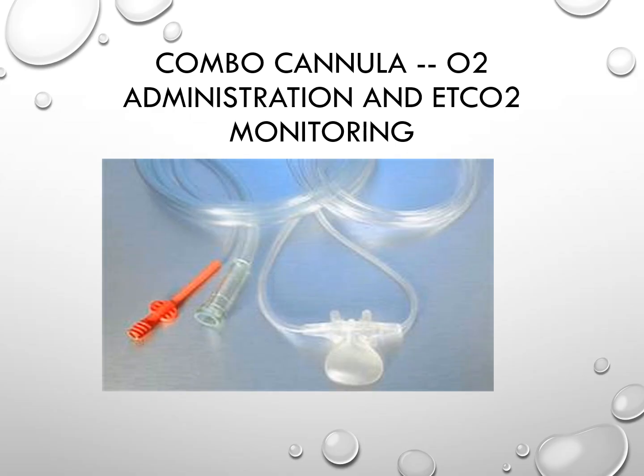Now, I have to say that these devices are not without their limitations. The higher the liter flow on the nasal cannula, the more dilution that can take place, the less accurate these devices can be. Just to be clear on that.